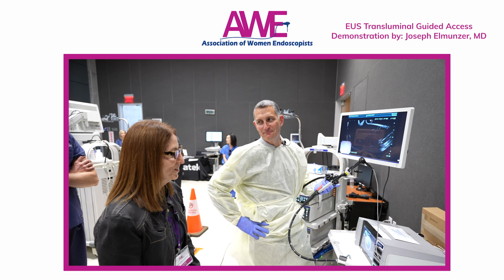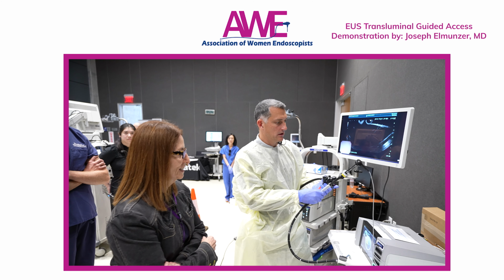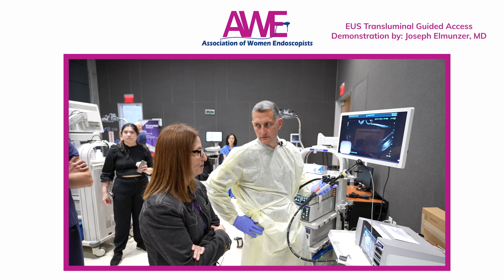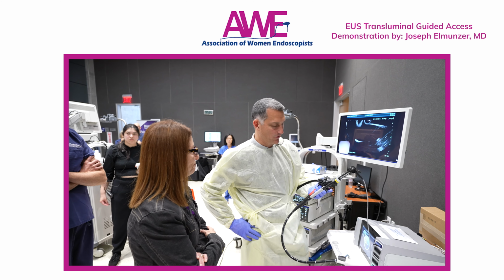Right. Okay, well, we're going to get started and demonstrate how we do this technique. Dr. Elmunzer has a simplified way of explaining it. Well, that I don't know about, but certainly we've been doing these for a long time.